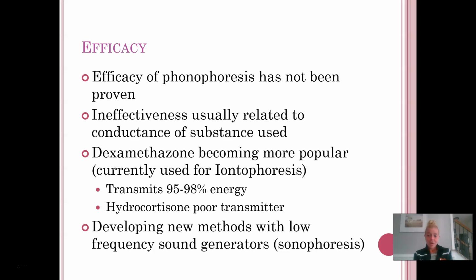Dexamethasone, which you may have heard of because that's probably the most popular medication that we use with iontophoresis, can actually be used for phonophoresis as well. It transmits 95 to 98% of ultrasound energy, so it can actually be driven down through the skin with ultrasound as well. Like I said, hydrocortisone is a poor transmitter. Those thick white creams just do not work very well. And they are looking at developing some new methods with low frequency sound generators to be able to use with medication as well.